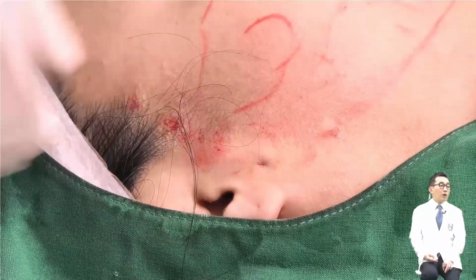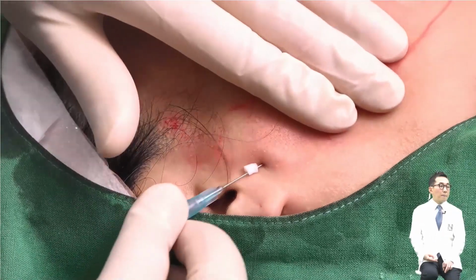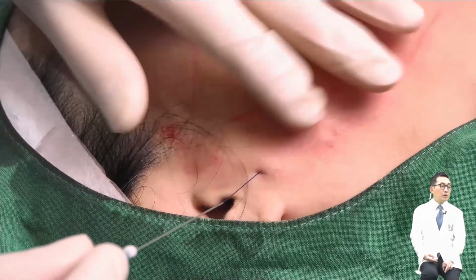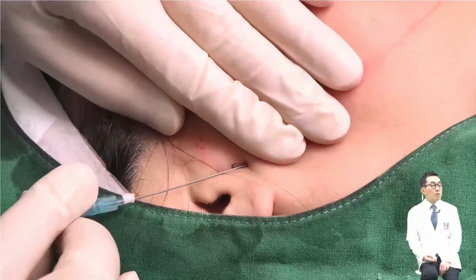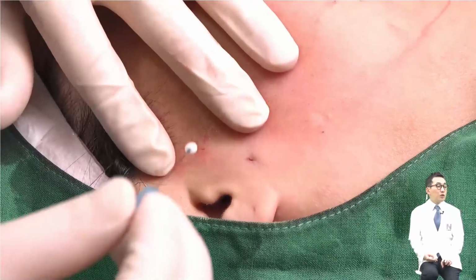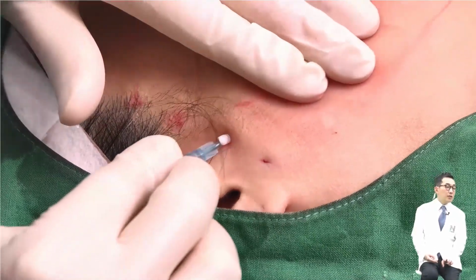Okay. I put another thread through the same hole. And remove the cannula, and flip and reinsert. When flipping in, at the moment the thread becomes invisible, you need to push in a little more and come out. If you push it in less, the folded end can be touched and visible in the hole. Next, insert 2 more in the second hole.